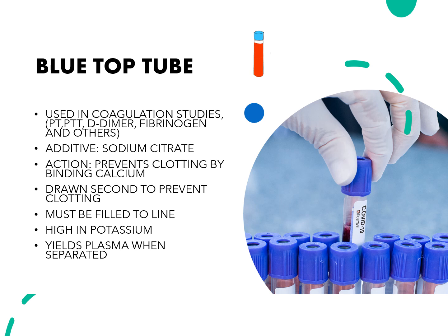So, for example, if you get the sodium citrate blood into your serum separator by accident, what could happen is you would have a low calcium value because the sodium citrate is binding calcium. Another thing that might happen is EDTA is high in potassium, so that might affect your chemistry as well. So for those reasons, we want the blue top to be next in the order of the draw.